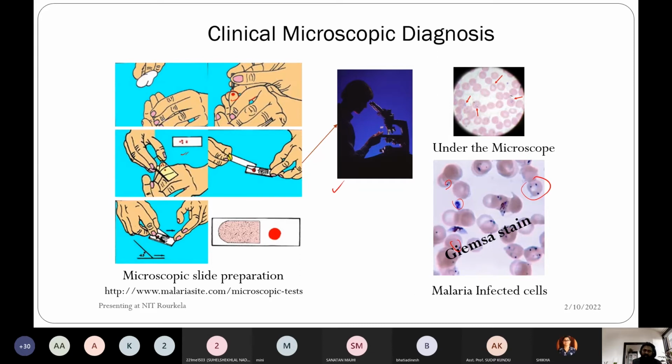Basically, if you take a thorough approach, this process generally takes 1 to 2 hours. Some people can do it quickly, but there is a possibility of misdiagnosis, and it takes a lot of time to do a single test.